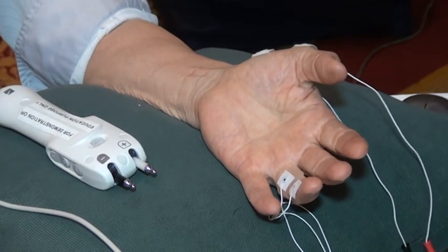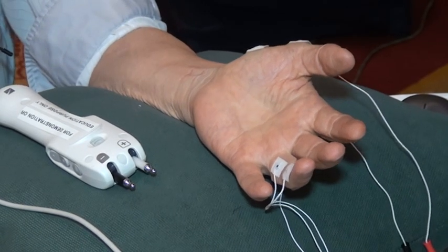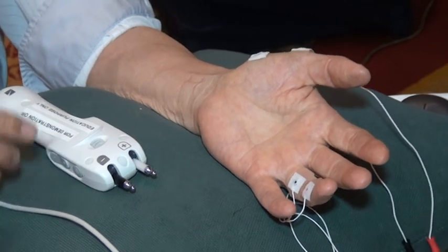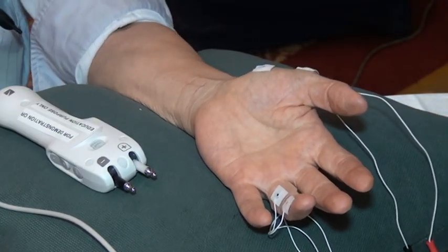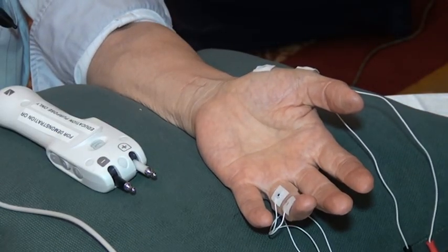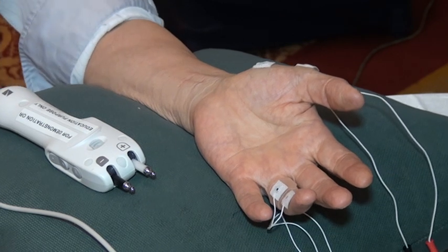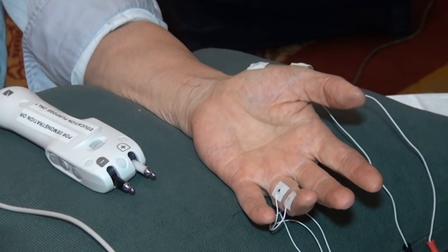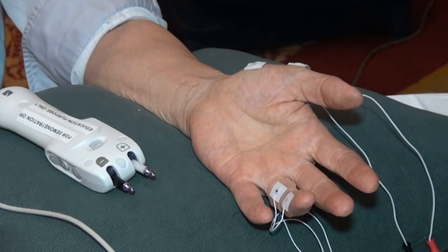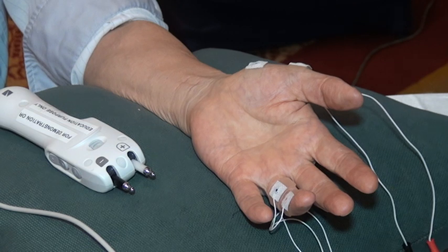Is this normal? If you're doing a repetitive stimulation, is this normal or abnormal? You see the amplitude change. This is big. You usually compare, pseudo-facilitation, the fourth one here. Pseudo-facilitation. Let me ask you: is this normal or abnormal? Usually, you consider this normal, right? Because there's a 10% change between the first one and second one.